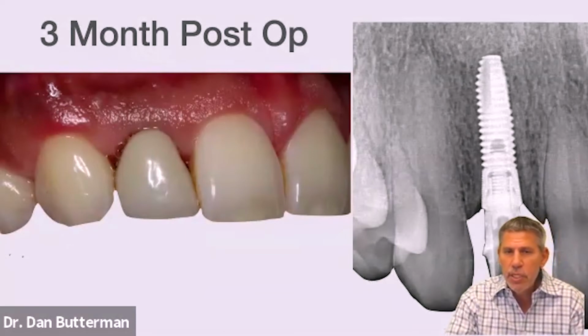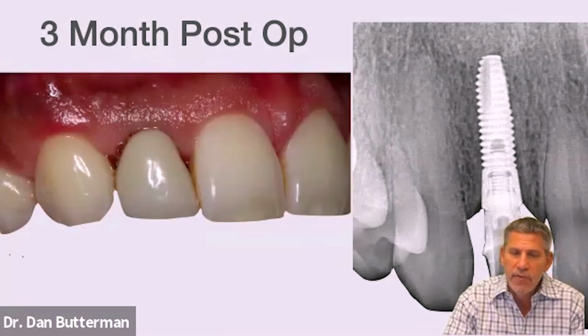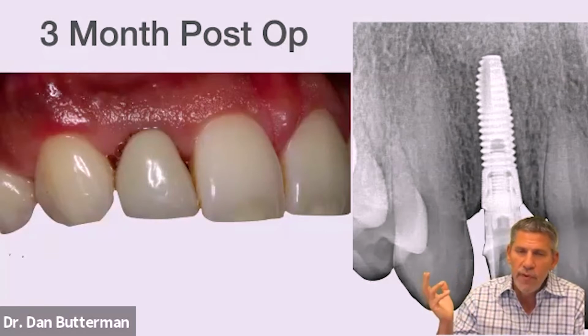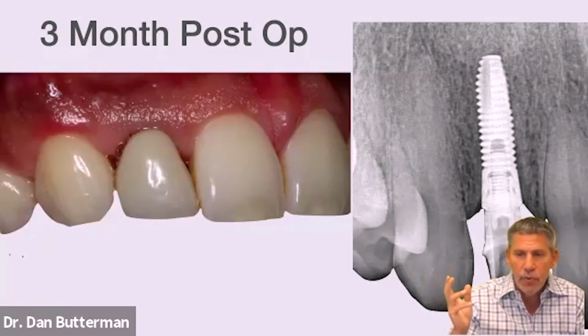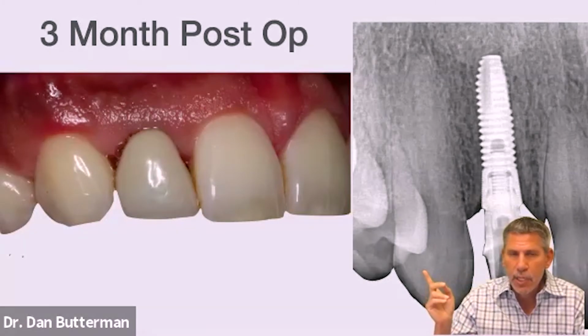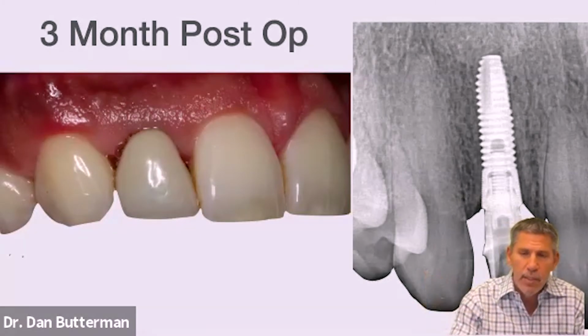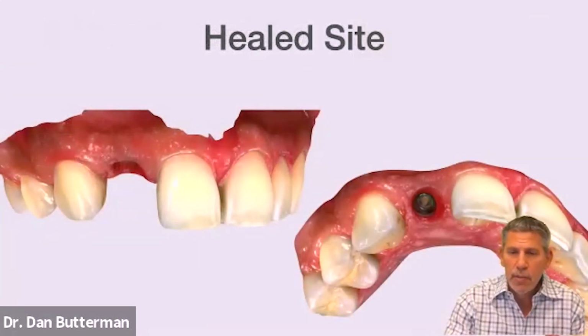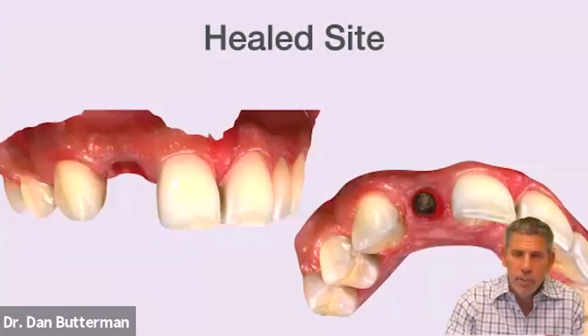We got a little bit of tissue recession right on the distofacial, and I was able to see my abutment margin. So I didn't want to just have a core file. I didn't want to have just a final restoration made for that abutment that was sitting on there. I wanted to have a new abutment made. So I just unscrewed that temporary that was on there, and I just did new images. Again, all I'm doing is using my Primescan for digital imaging.